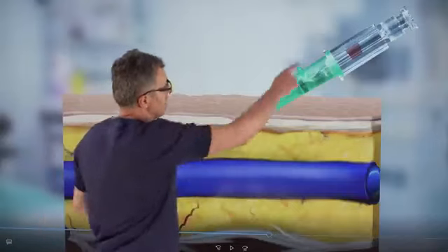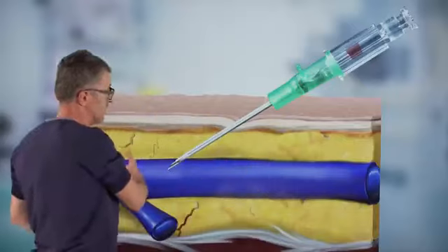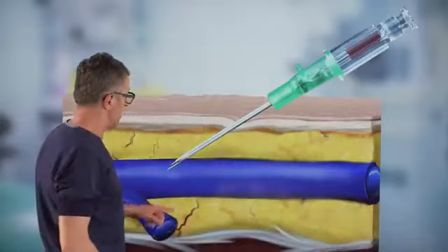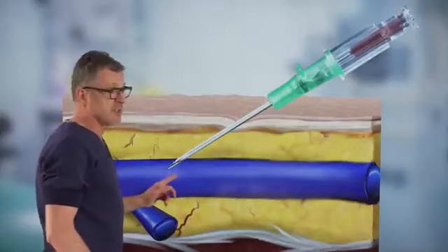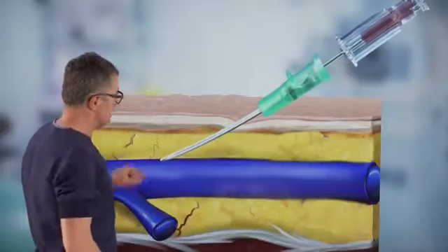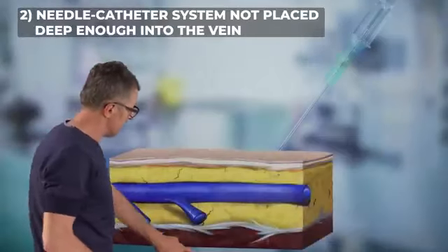So in this case, we should decrease the angle of the needle and advance the catheter needle system further. But in this example, this doesn't happen. The operator is happy with the fact that this is already inside the vessel, and the attempt to feed the catheter will result in a catheter placement inside the subcutaneous tissue, but not intravenously.